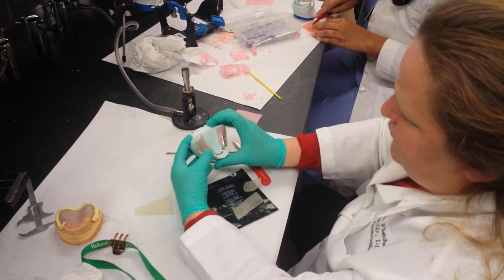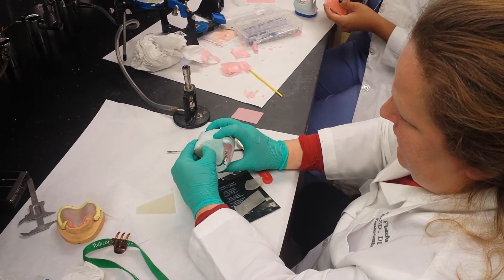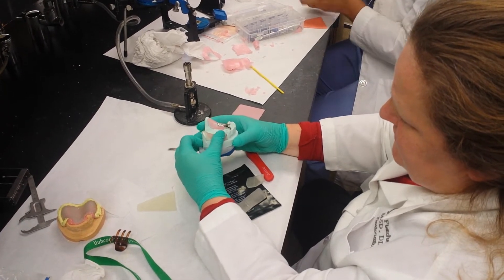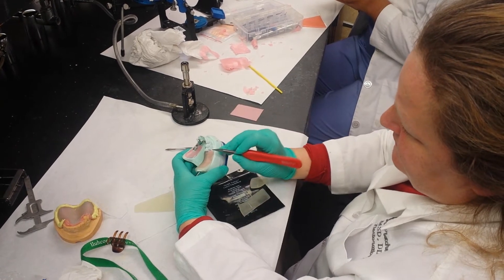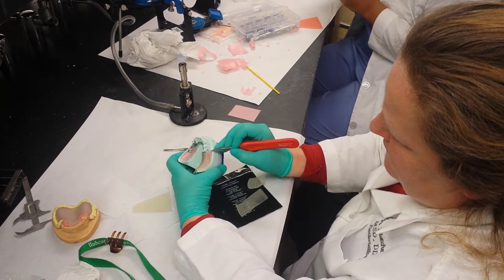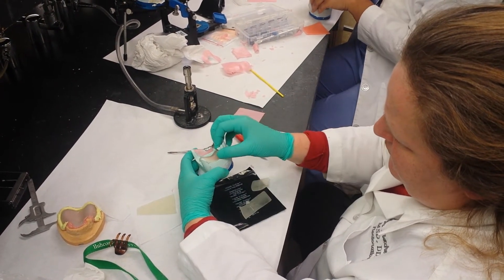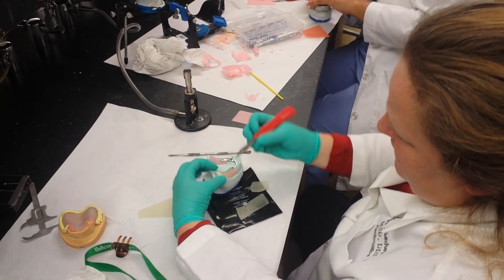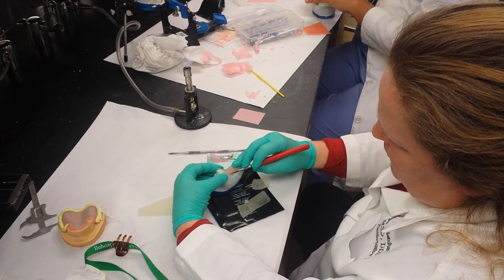I want it to press into the framework so it'll hold on. Then I have it go over all of the edentulous area. I want to make sure that I cut it shy of the adjacent tooth so that it won't get into the undercut of the adjacent tooth. And then I want to cut it shy of the vestibule by about two millimeters.